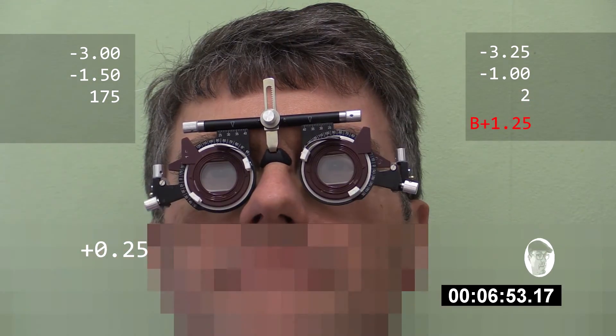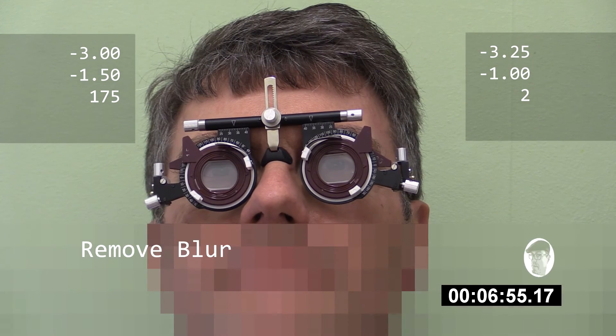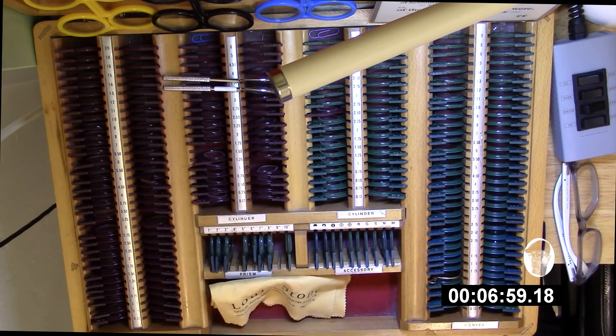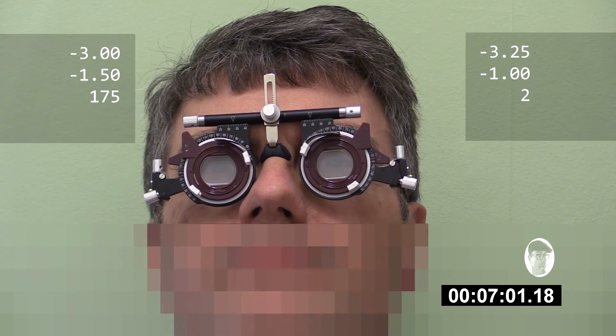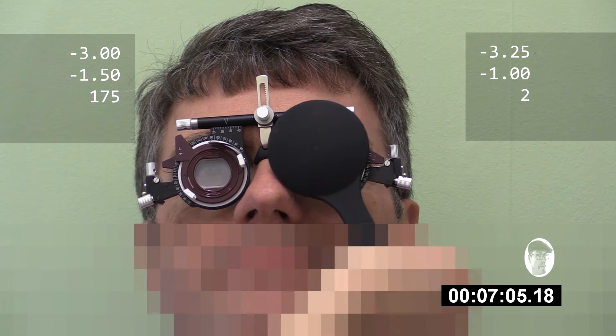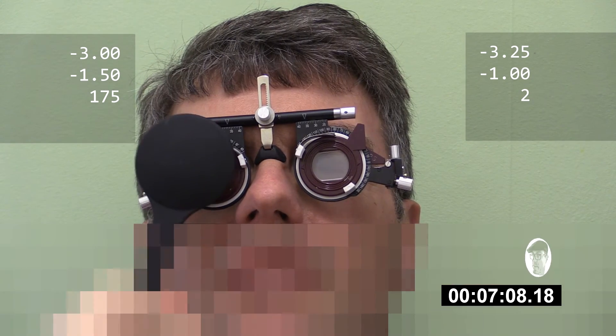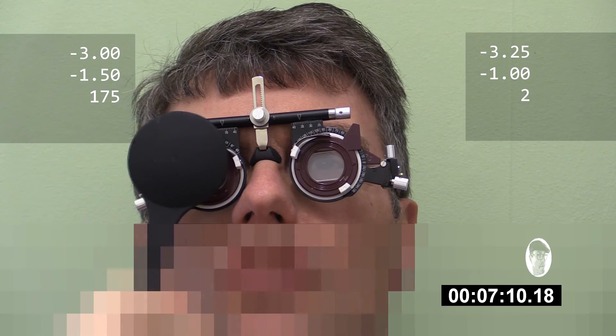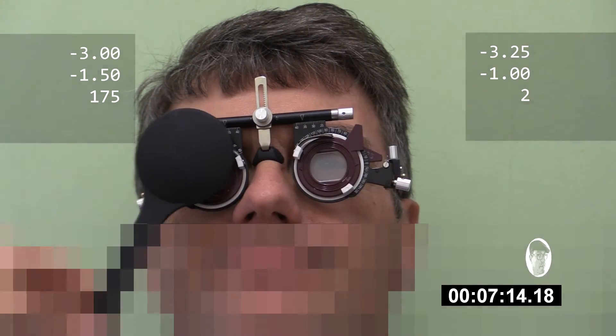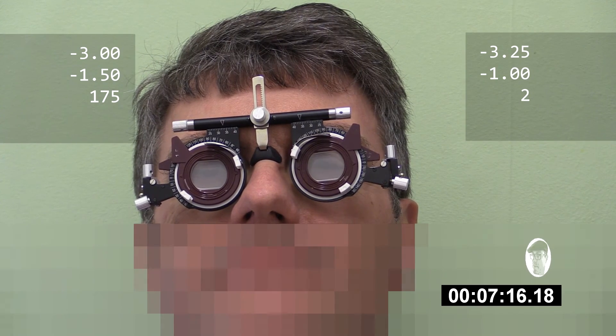We'll pop that lens out there. How's that looking? Looking really good, yeah. Lots of shot, yeah. And you'd still be able to read the bottom line? Yep, easily, yep. And if I'd covered that eye, would you still be able to? Yep. And there. There. I don't know, I suppose the other way, but yeah. 350. Okay. If I were to put my lovely little pinhole in front there.